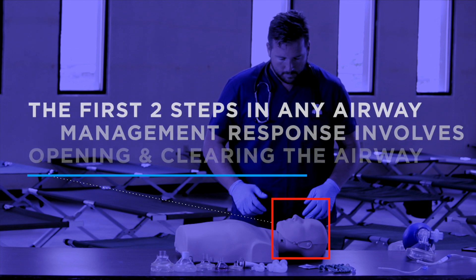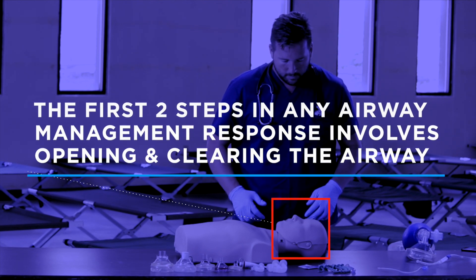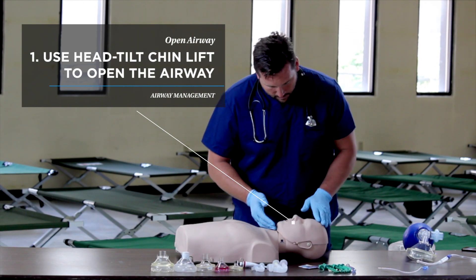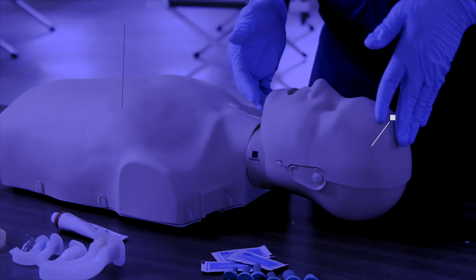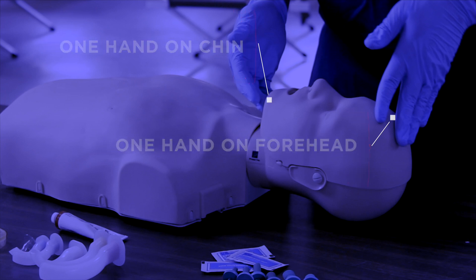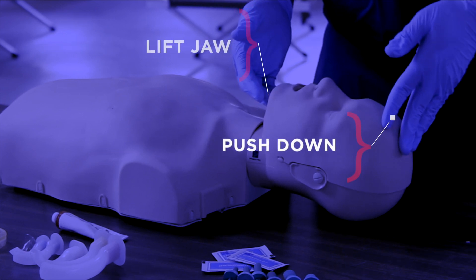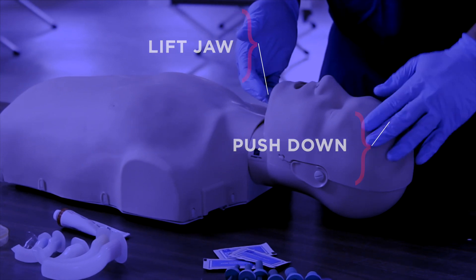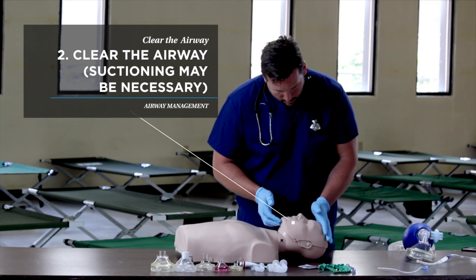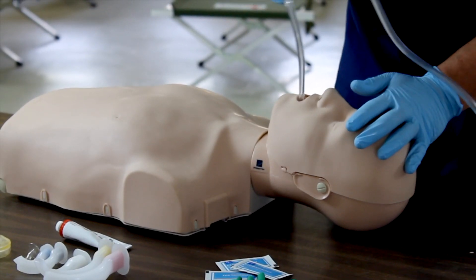The first two steps in any airway management response involve opening and clearing the airway. First, open the airway using a head tilt chin lift by placing one hand on the forehead and the other on the chin. Push with the palm to move the head back while lifting the jaw to bring the chin forward. Second, clear the airway. Suctioning may be necessary to remove foreign material or secretions.